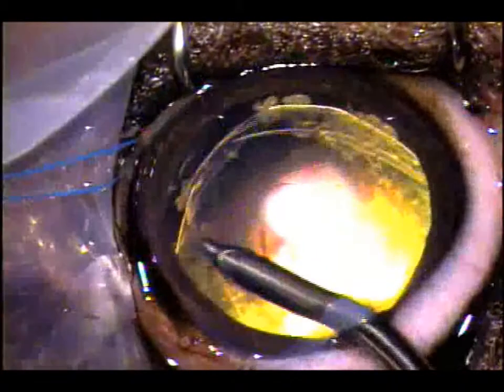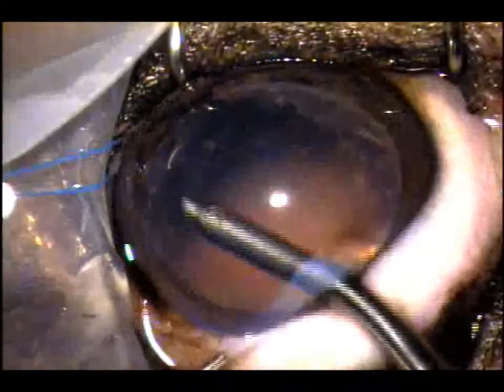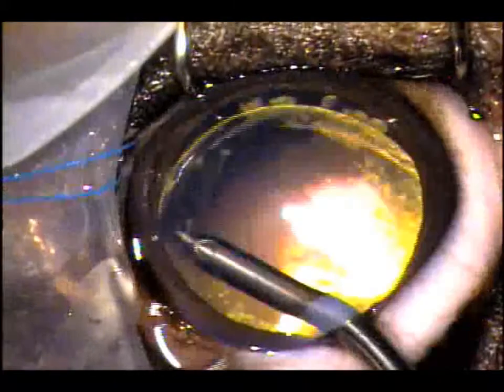we see the edge of the lens capsule at the top of the image and towards the left of the image, subluxating forward.